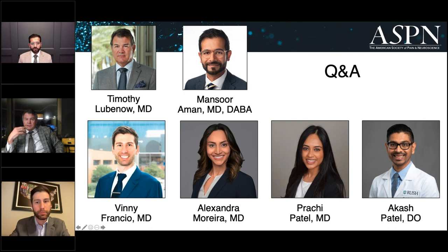I agree with you, and I'll summarize that in 2 aspects as well. You can choose to do an epidurogram, and that will clearly highlight a margin of safety. That's one approach. And having done hundreds of these cases, when you have taken enough bites out of the ligamentum flavum, you eventually stop getting ligament back, and that's a good indicator that this is a good time for us to stop.